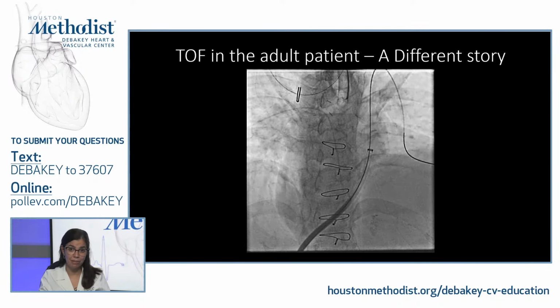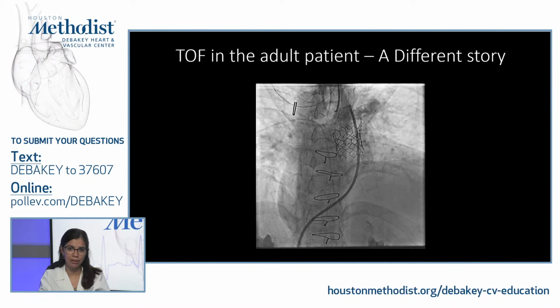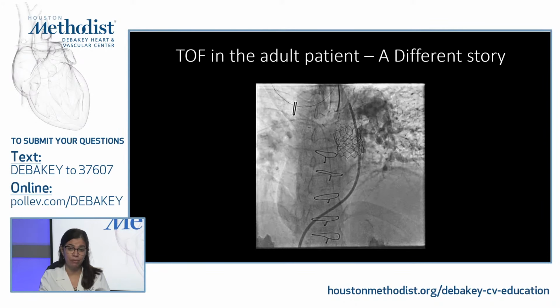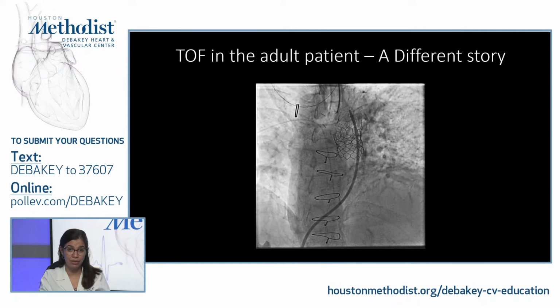So we can see here a patient with severe pulmonary regurgitation in angiography who underwent a percutaneous placement of a pulmonary valve that took care of the pulmonary regurgitation. But first, to evaluate candidacy, we need accuracy in the measurements, and also to plan the procedure afterwards.